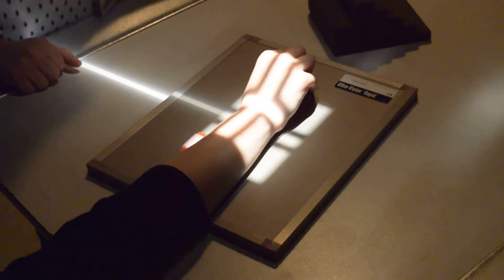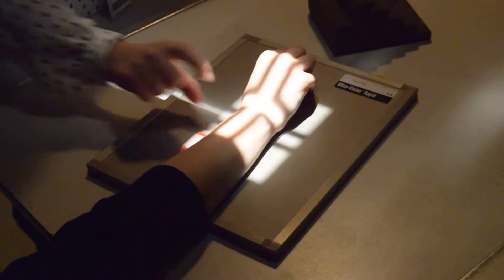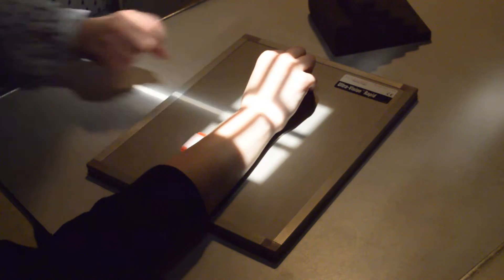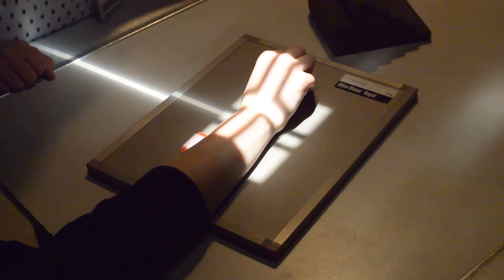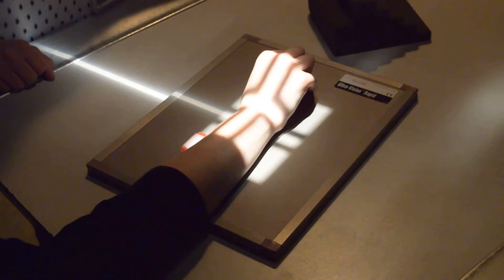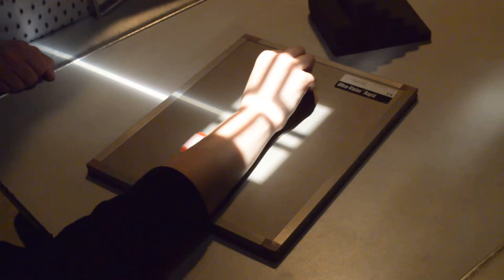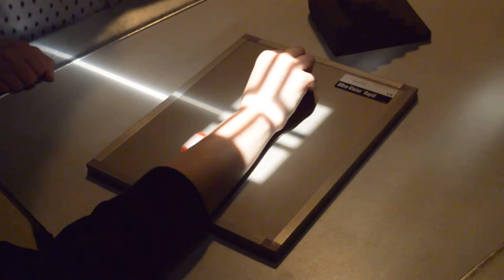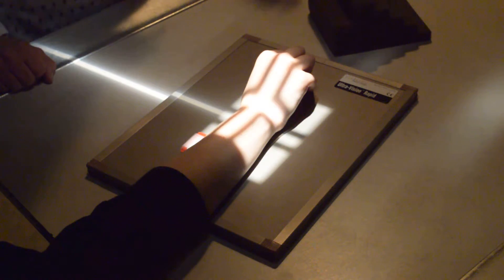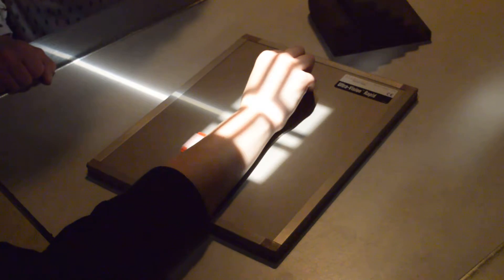A marker on the lateral aspect. You're going to measure right where your central ray is going through. Make sure your patient has good positioning. Ask your patient to hold still and click.